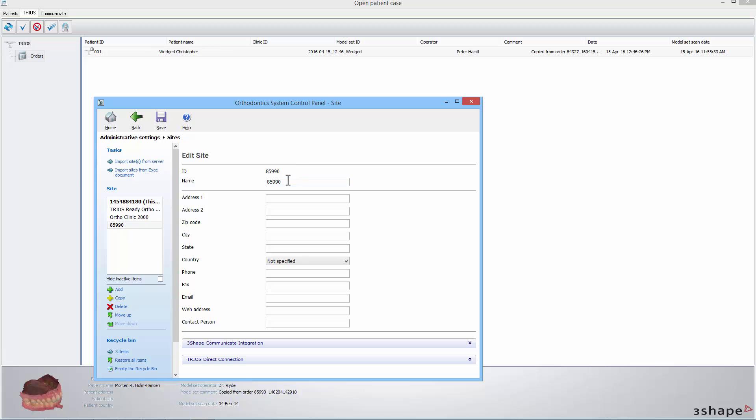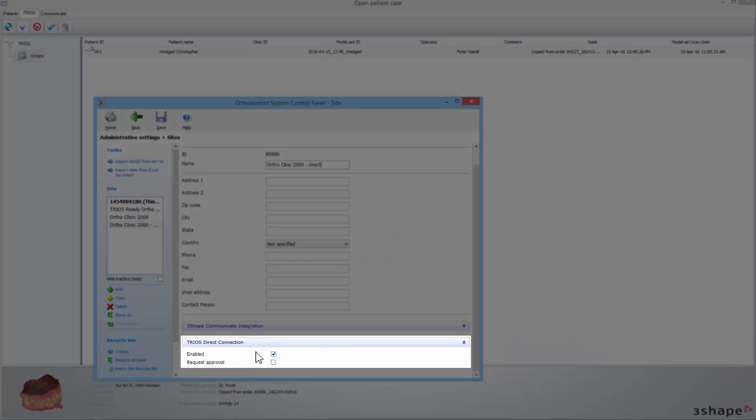The new site has been automatically added. You will need to fill in its name. Also, you will notice that the TRIOS Direct Connection has already been automatically enabled.